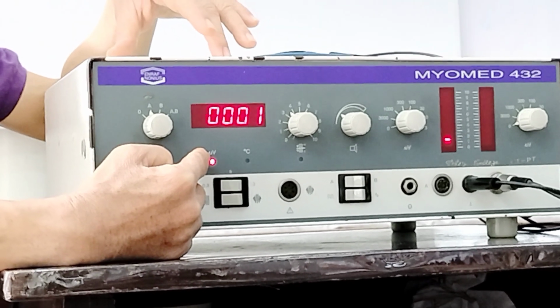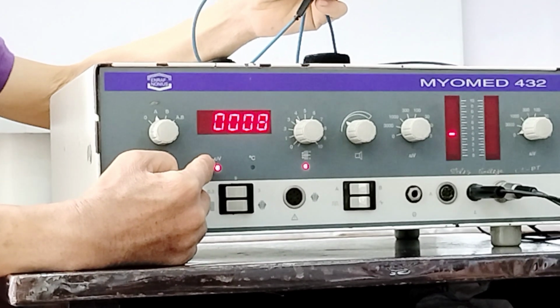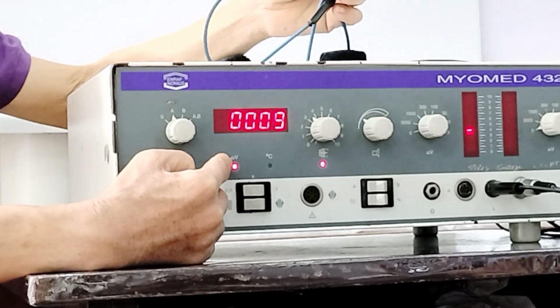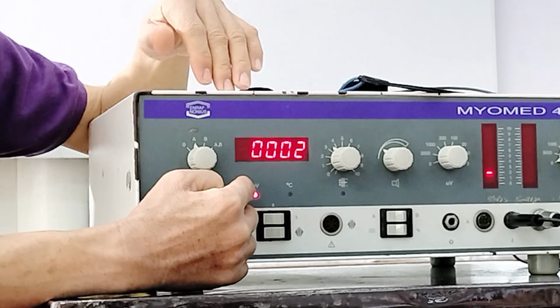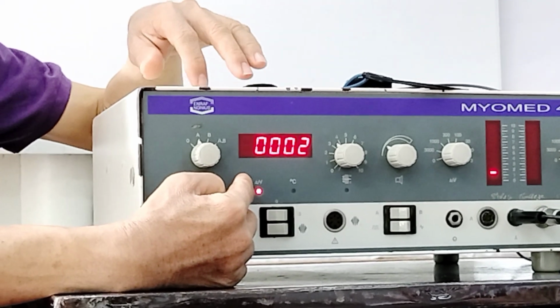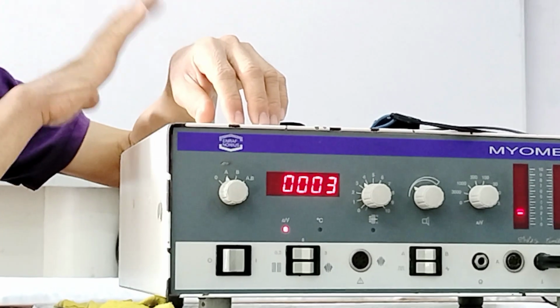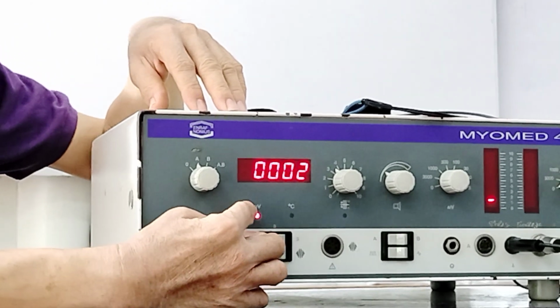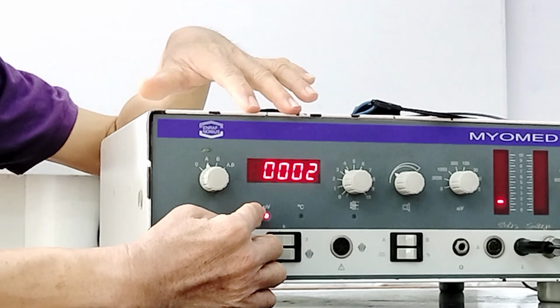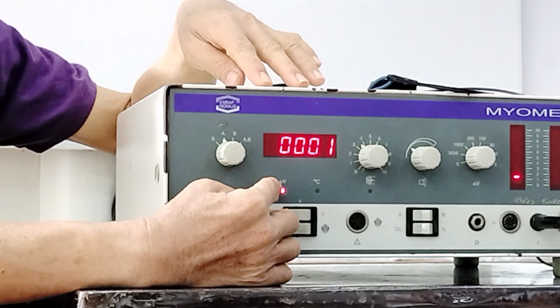You have this although the electrode has not moved, right? So that is not a motor unit action potential received, but probably signals from the surrounding, but registered as some microvolts voltage. If it lights up when the electrode is on the structure, that would indicate that the machine detects the motor unit action potential.